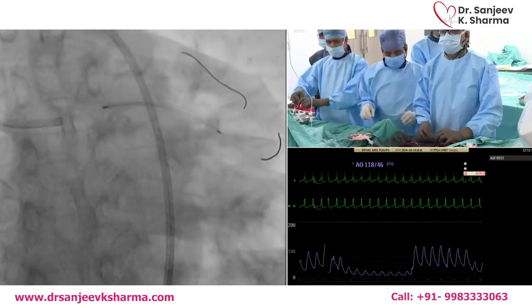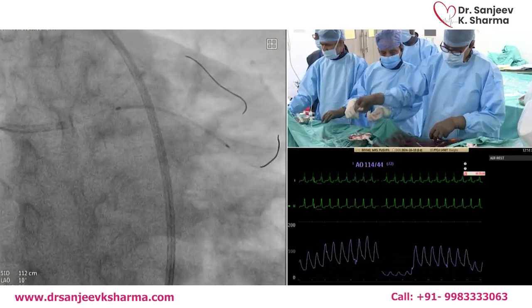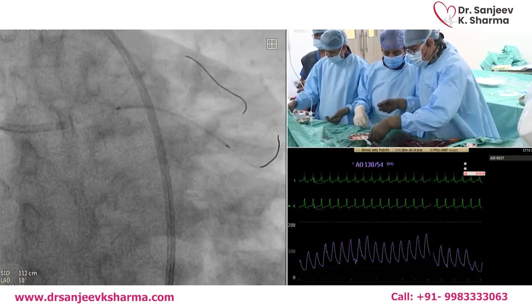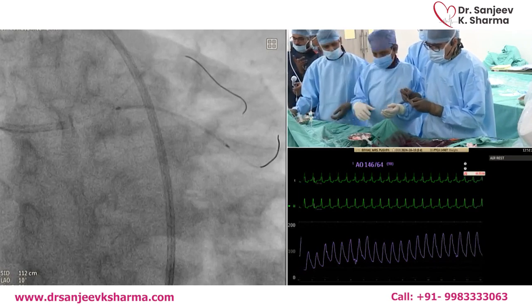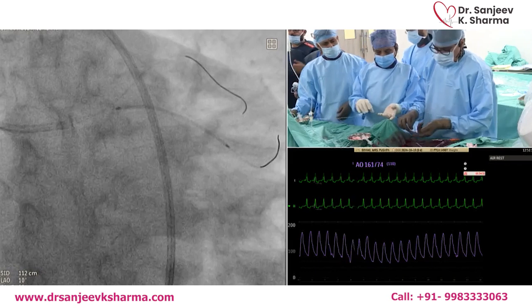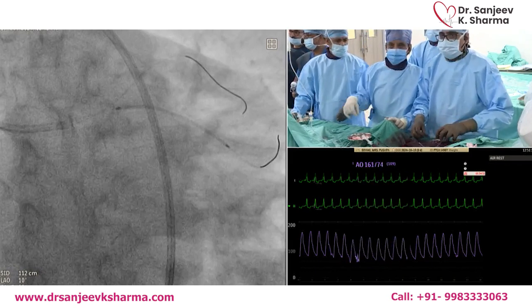As I utilize sometimes in a bifurcation, you have to decide where you're going to look. You cannot be looking very closely, millimeter by millimeter, both proximal and distal. Otherwise, you're going to end up missing the most important. So at least you choose a length that is long enough. You don't have to worry about the distal, and then you focus on your proximal positioning much better.